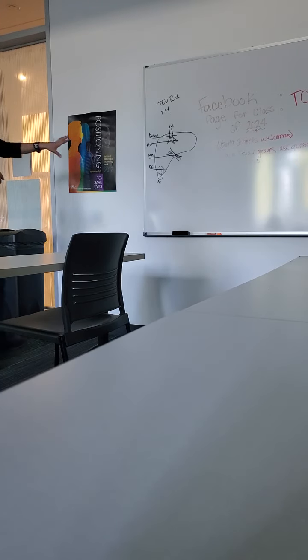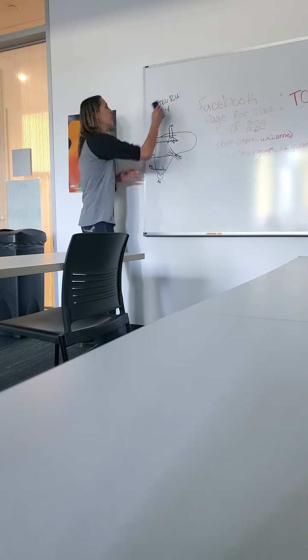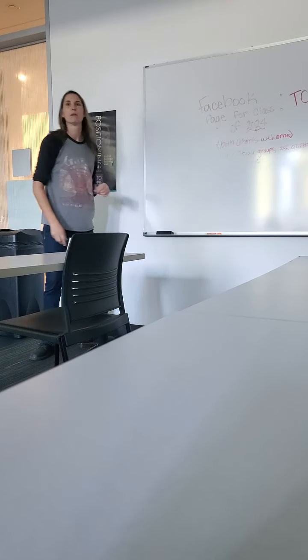Any questions so far? So when you sweep for the borders, are you having to prove that with a live kind of feed of some kind where it's showing a video of you sweeping through? So they call those cine clips, and we use them from time to time, but we just want to include that border in our still images. Oh, okay. Yeah. So optimizing the liver, we want that kind of even gray.